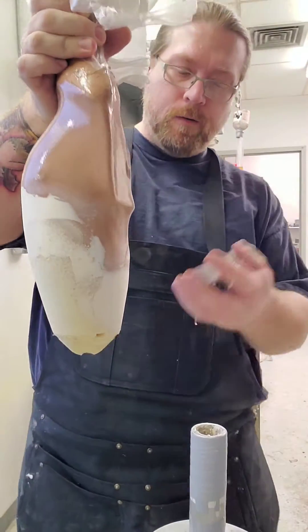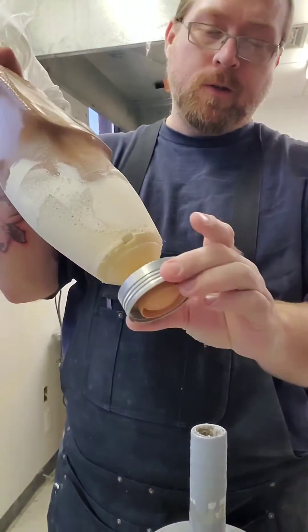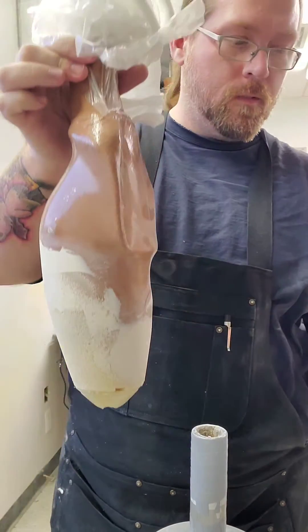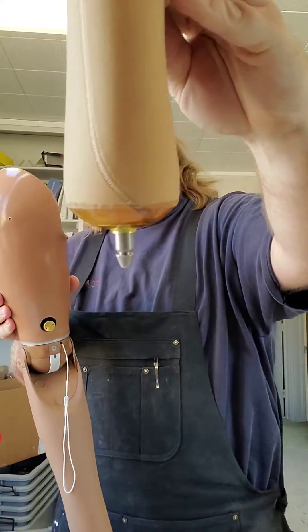I have the shoulder here foamed up to where the elbow unit is going to attach. Now it's getting laminated on right in there. Stack is on the arm, got a little pin lock on there.